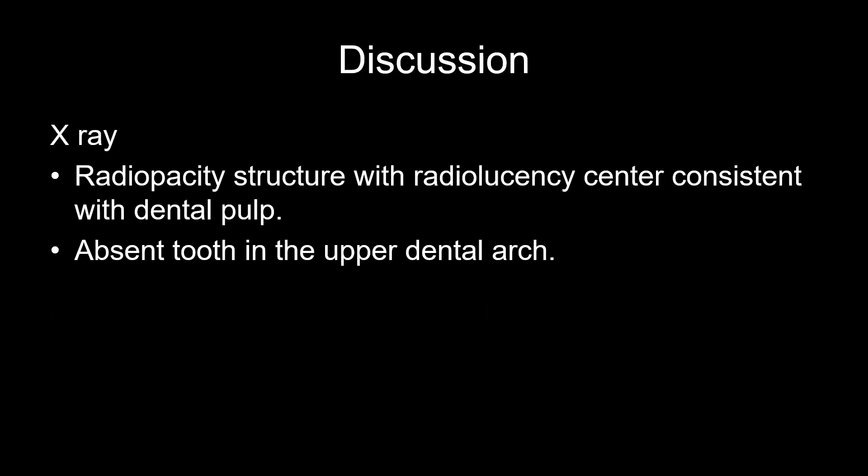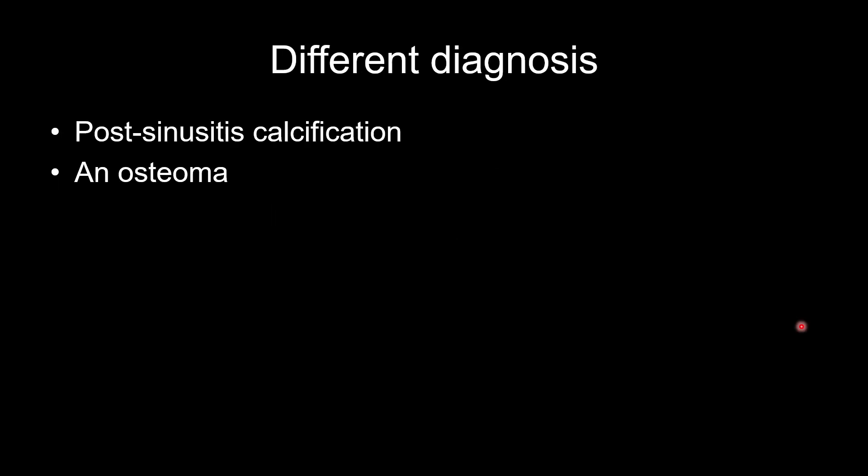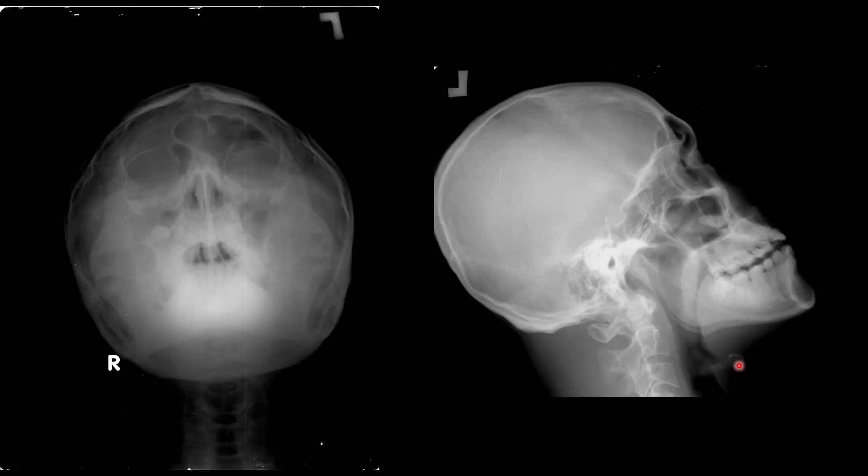In X-rays, we can see the radiopacity structure with radiolucency center consistent with the dental pulp. And we can see an absent tooth in the upper dental arch. The differential diagnoses are post-sinusitis calcification and osteoma. And the conclusion: this is a beautiful case of ectopic tooth in the right maxillary sinus.